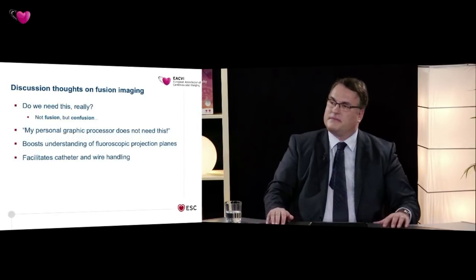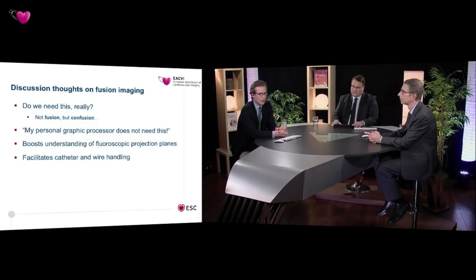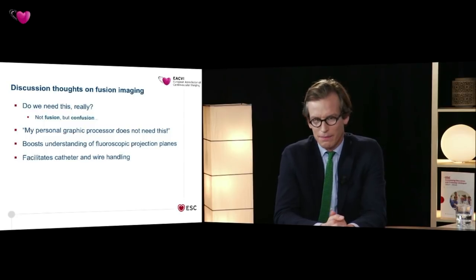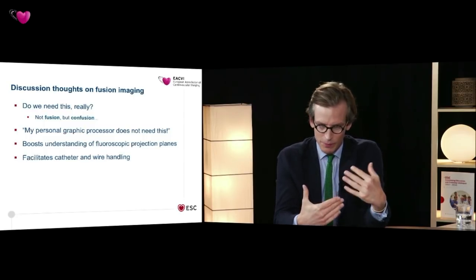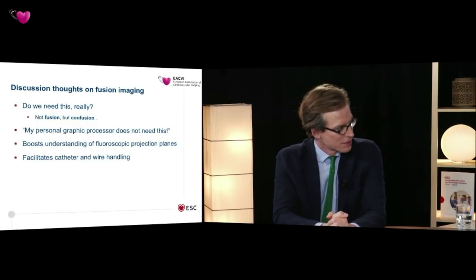So I can sum up my experience with fusion imaging. And of course, you run into colleagues that say, do we really need this? Isn't this overlay more confusion than fusion? And other ones say, I have a graphic processor that does not need overlay, I do this behind my forehead. But as I hope to have shown you, it really boosted my understanding of fluoroscopic projection planes, and it also facilitates catheter and wire handling. So I think we do need this.